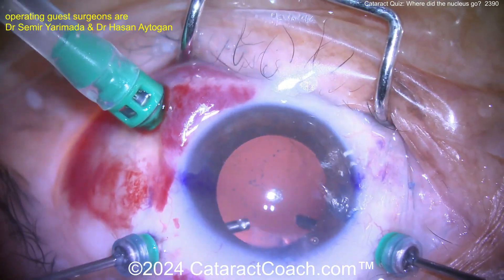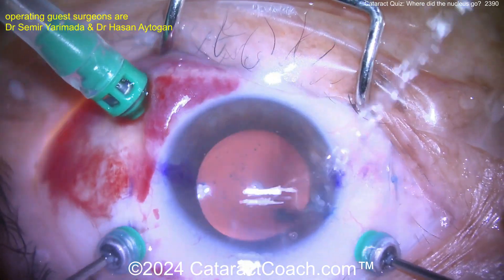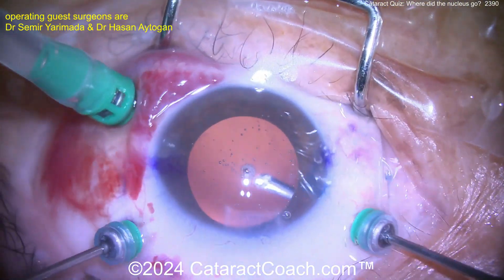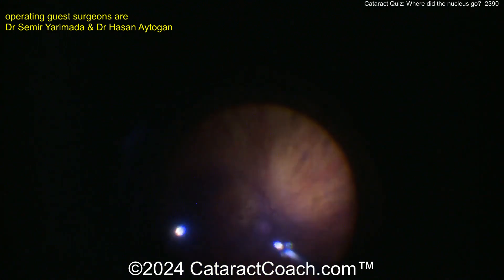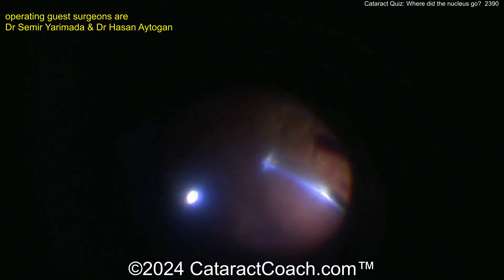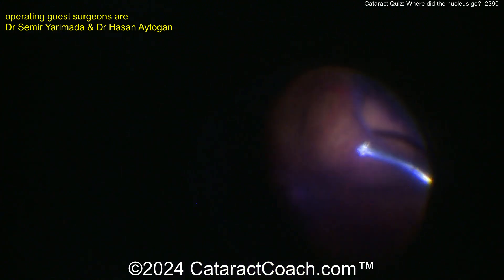If you're not a vitreoretinal surgeon and you don't have a vitreoretinal viewing system in your scope, you can actually stop the case, put on an indirect ophthalmoscope, and look back there. Here's the light pipe and the posterior viewing system — and in fact there is no big nucleus back there. The patient is getting a full vitrectomy.